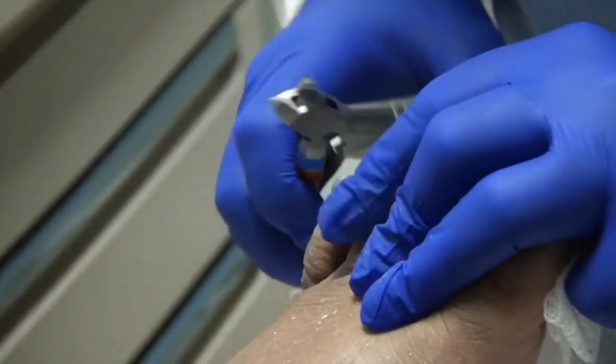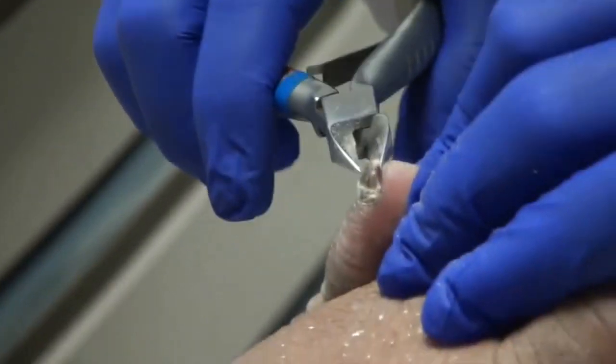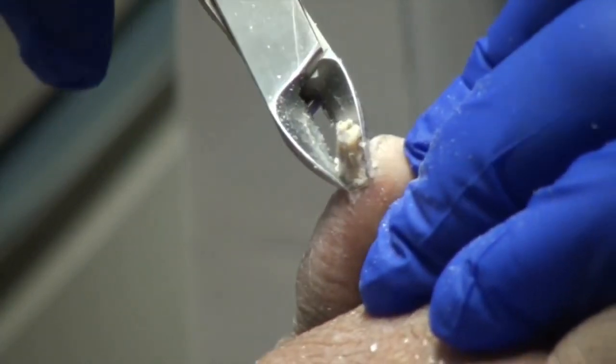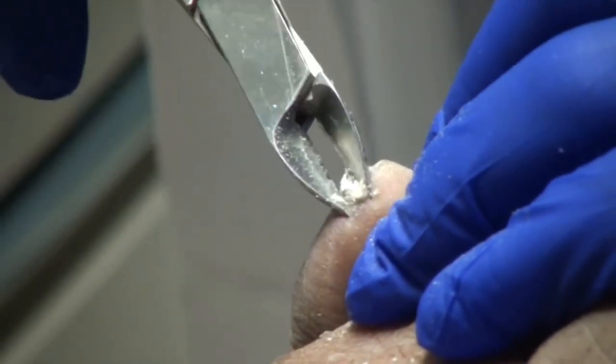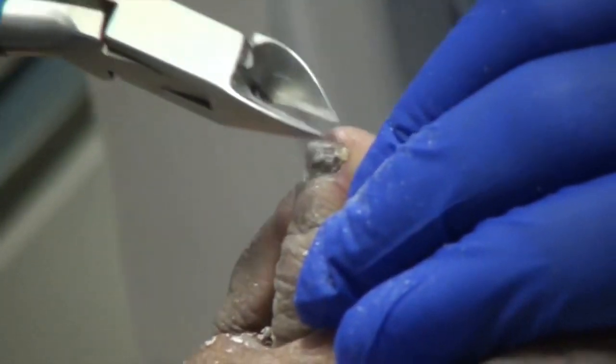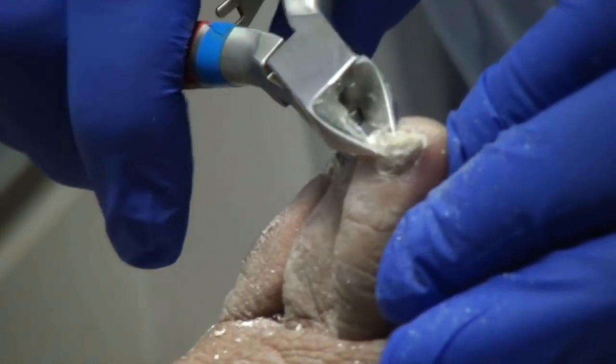So let's start back with this foot here. Let me have you turn it just a little bit. The rest of these — I mean, they're pretty thick, but they're not long or ingrown or anything.